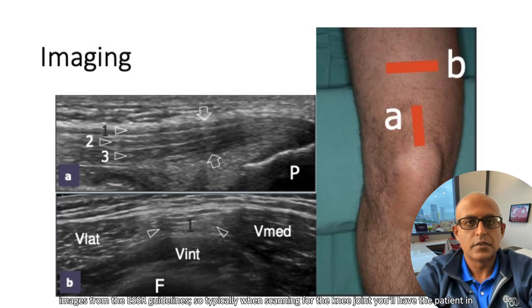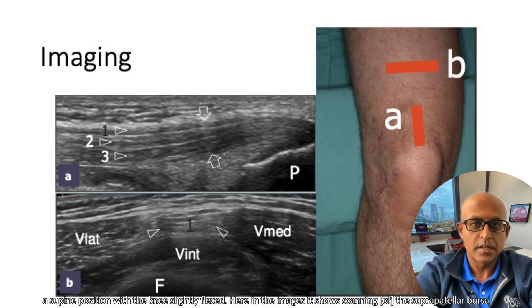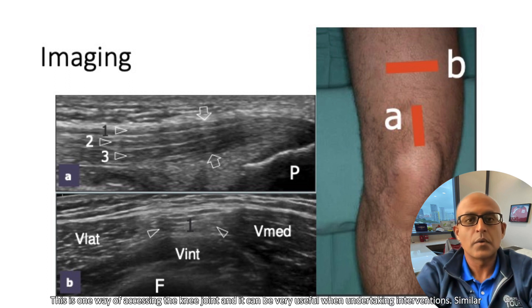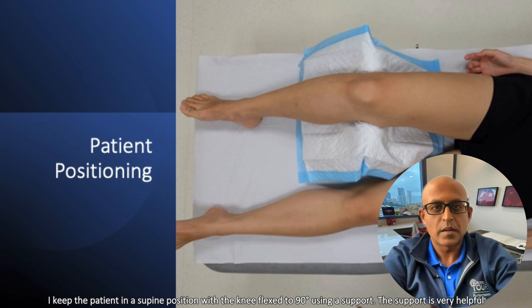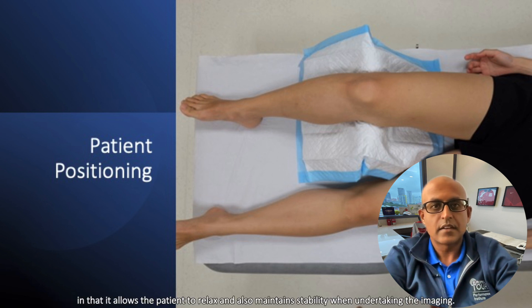So typically, when scanning for the knee joint, you'll have the patient in a supine position with the knee slightly flexed. Here in the images, it shows scanning the suprapatellar bursa and the quadriceps tendon. This is one way of accessing the knee joint, and it can be very useful when undertaking interventions. Similar to the ESSR guidelines, I keep the patient in a supine position with the knee flexed to 90 degrees using a support. The support is very helpful in that it allows the patient to relax and also maintain stability when undertaking the imaging.